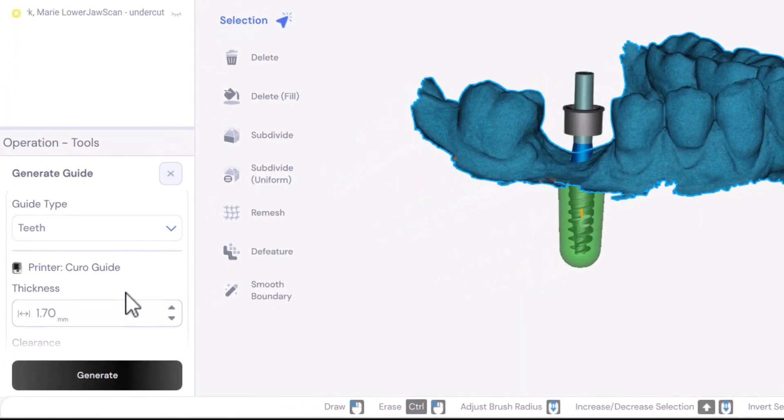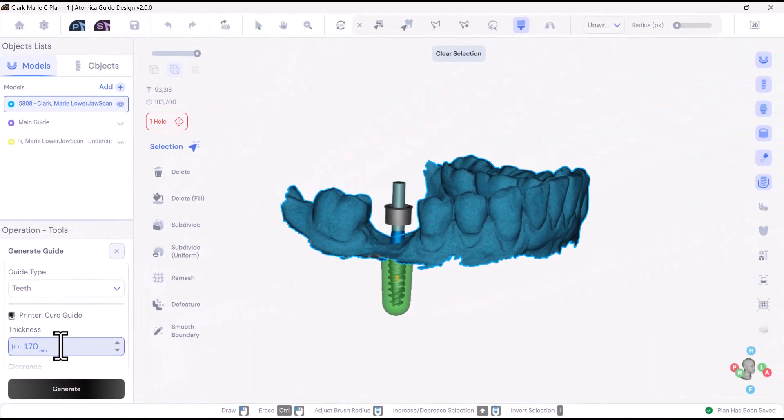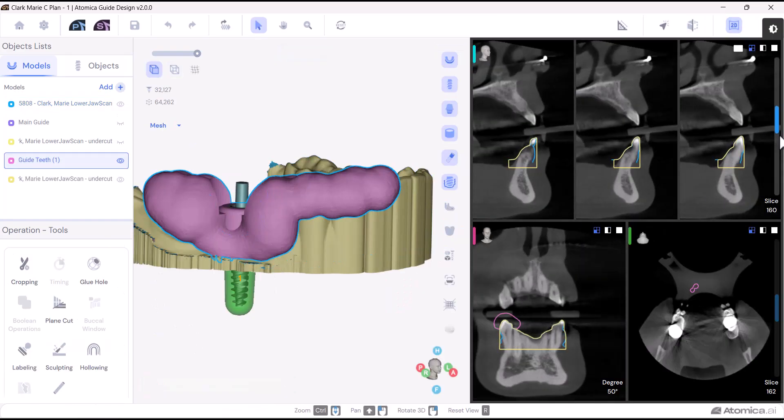Let's start with the thickness. The thickness of the guide plays a crucial role in its durability and hardness. Ideally, the thickness should range from 3 to 4 mm, depending on the printing material. If the thickness is less than this, the guide becomes fragile and prone to breakage. Conversely, if it exceeds this range, the guide may be too thick to fit easily into the oral cavity.